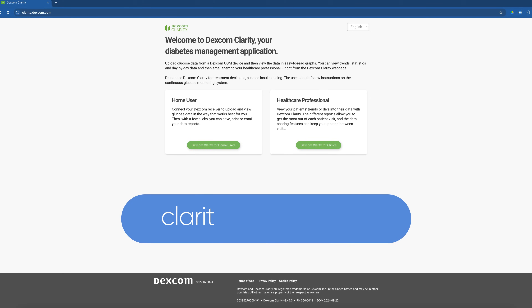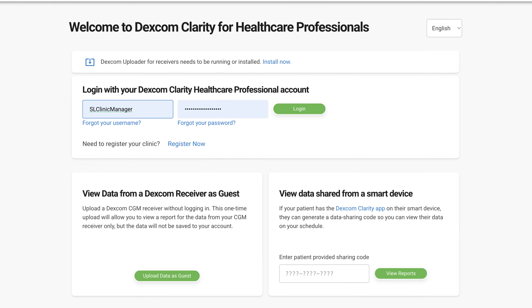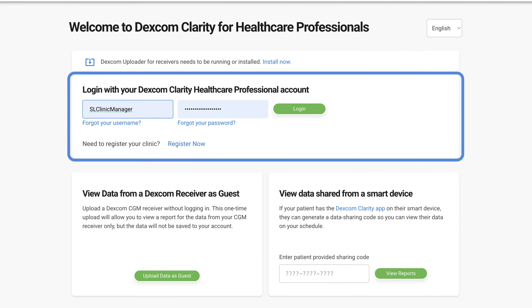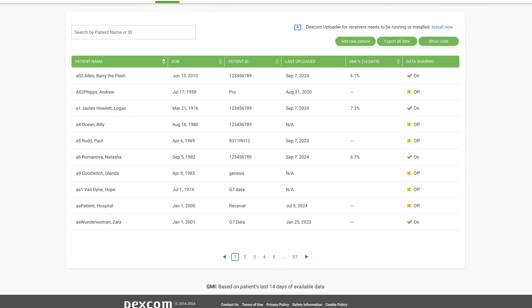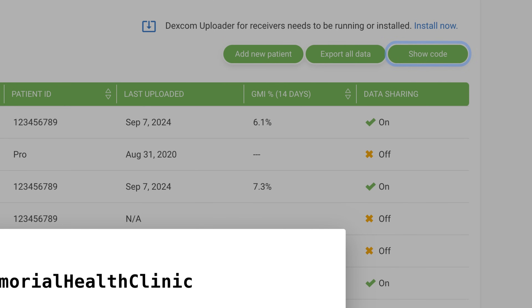Go to the Dexcom Clarity website. Select Dexcom Clarity for clinics. Log in with your secure credentials. Select show code to view your single clinic code.